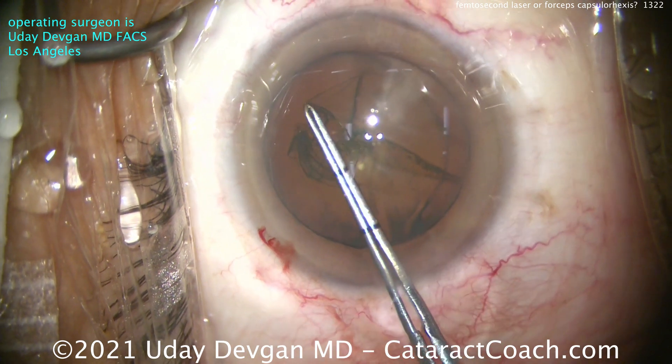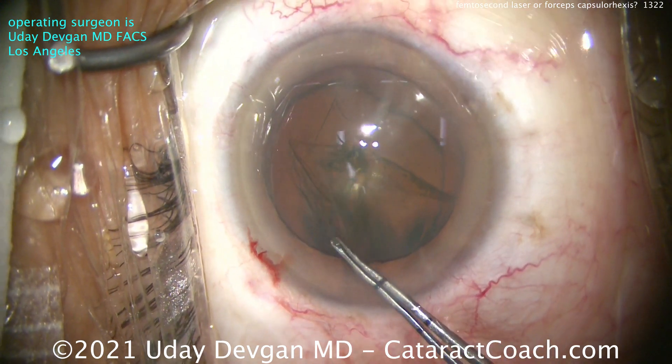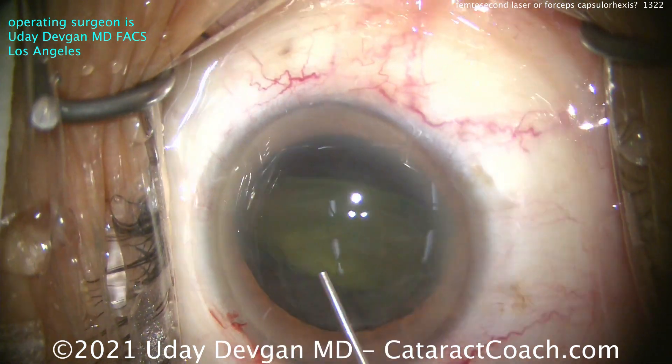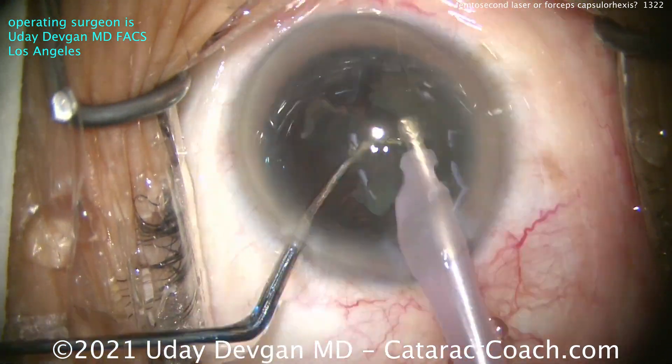It's a continuous, clean, smooth edge. If you look at the scanning electron micrographs of these, you'll see that it's really quite beautiful and strong. Let's speed up the rest of the case — this is not the important part. We want to discuss the capsulotomy opening comparing those forceps to the laser.